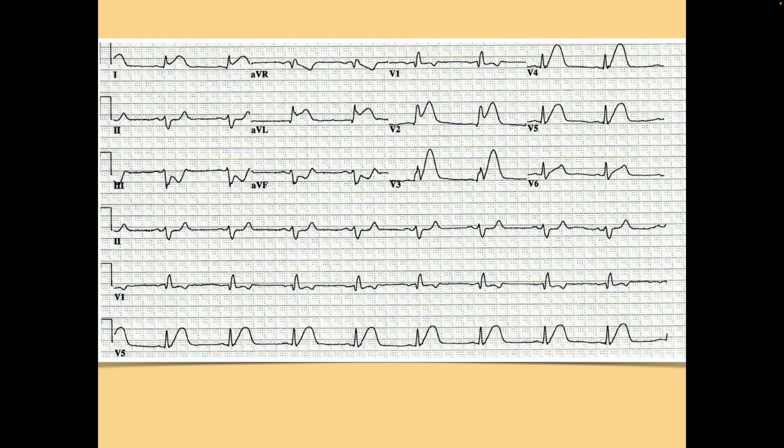But there is absolutely enough for code 3, cardiac hospital, do another 12 lead really quickly, because the thing about hyperacute T waves is this is going to look like this quickly. If you know that that's what it is, this is an excellent example, one of the best examples ever.